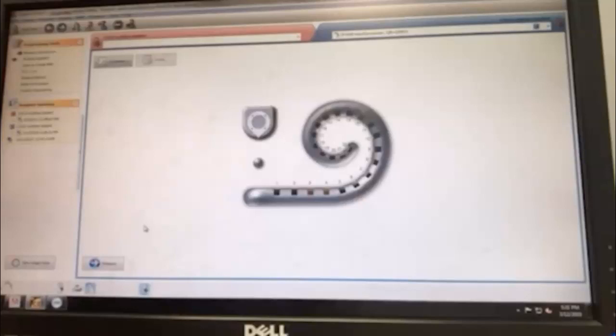And there's 3 or 4 different companies that make cochlear implants. She's going to go through a couple of them. And again, I'll stop it and highlight things as we go.